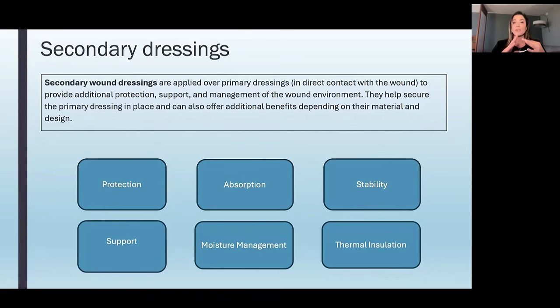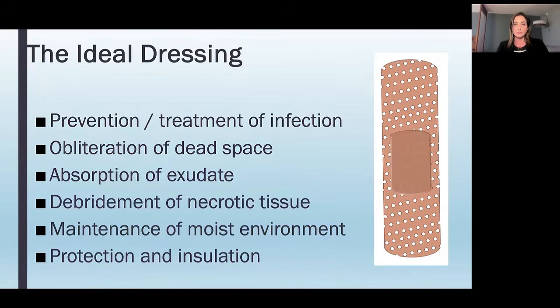So you're covering it up. They can help with absorption. They help with stability, so basically leaving it in place. They can also be supportive, so just helping the patient feel secure about the wound. They can also help with moisture management and thermal insulation, so keeping the temperature of the wound ideal.